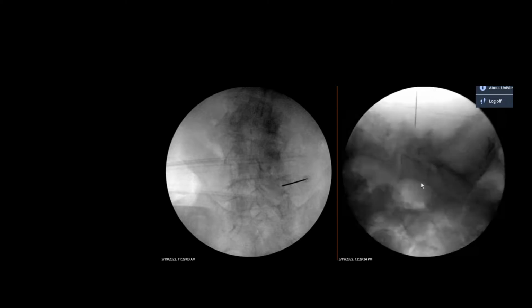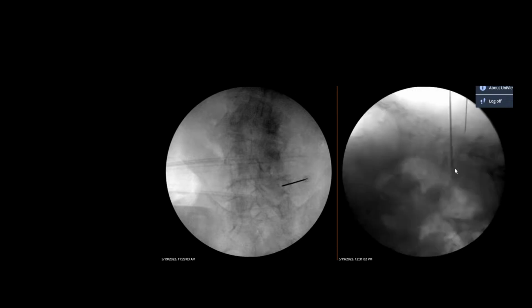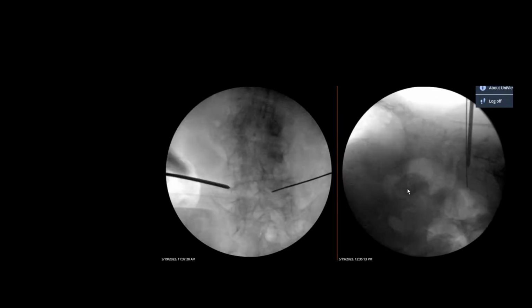Now when I'm adjusting for the L5, practically I'm just looking to see the end plate, and I go back and forth until I find the good view, where I only see the pedicle of the 5 and end plate of the 5, barely pedicle, the end plate of the 4. And in this view, I put already my first Jamshidi in and get some bone marrow to mix with my biologic. Then we perform OLIF, transpsoas OLIF in this level.